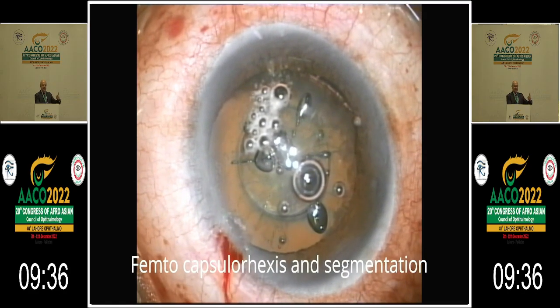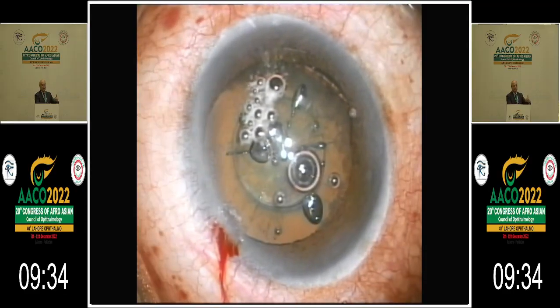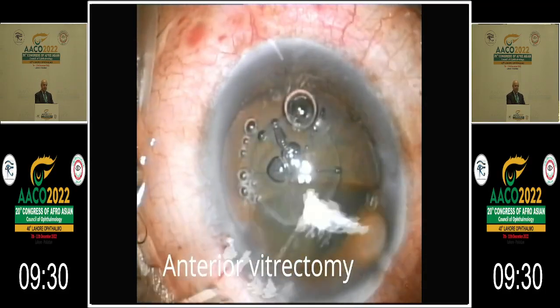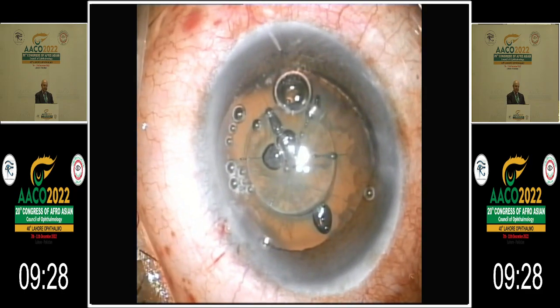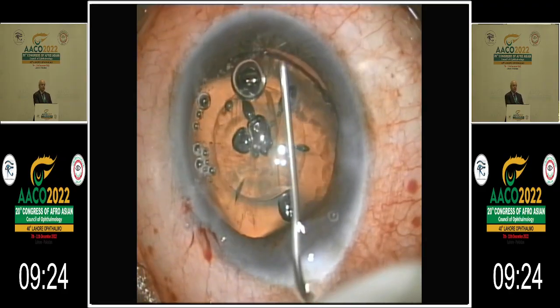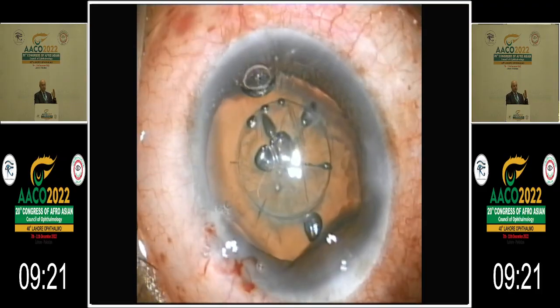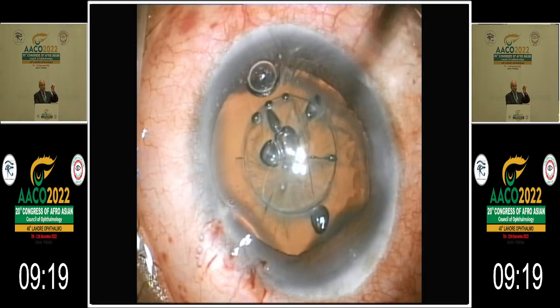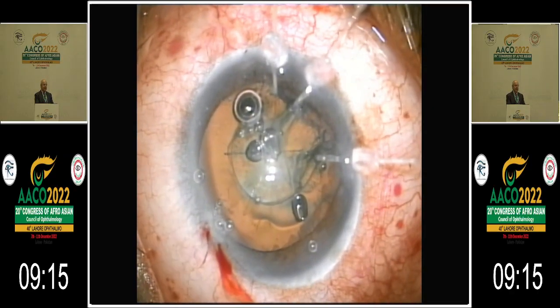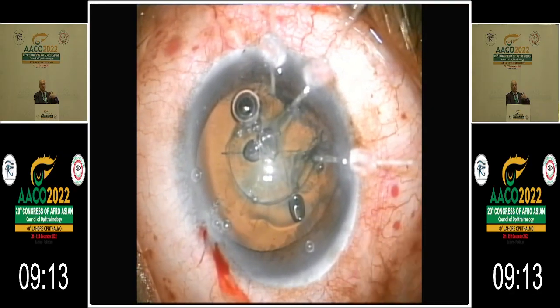What made things easy here is that I had already done the incisions and the capsulorhexis before I start, then removing the vitreous that is prolapsing from the area of subluxation. As you know, this is traumatic subluxation, so there is injury in the zonules in one area, but this is not a progressive disease. Then you try to use all the tricks you have.